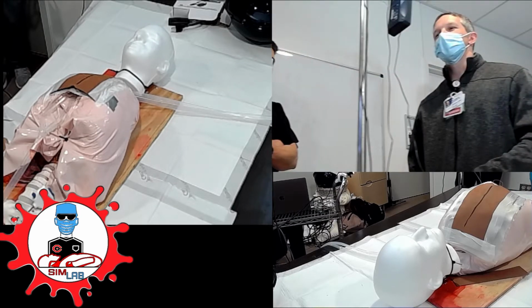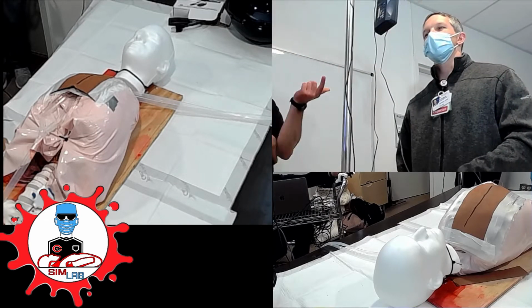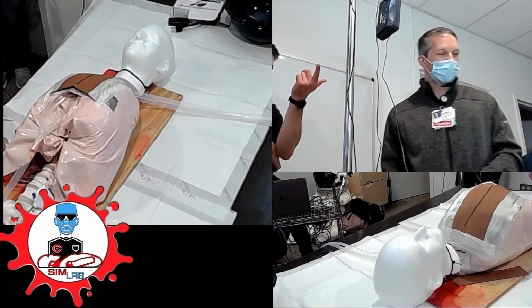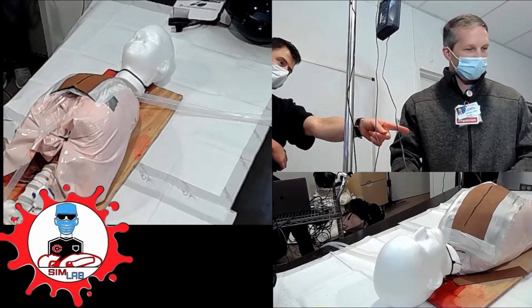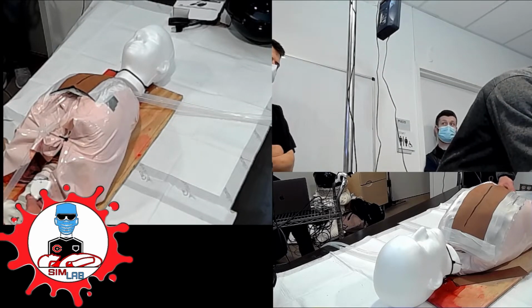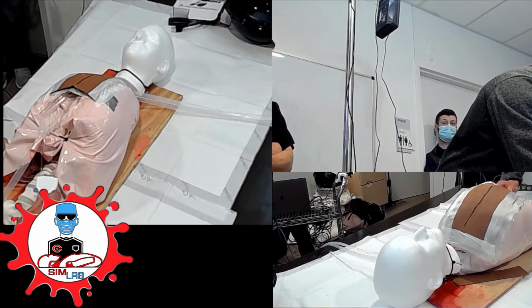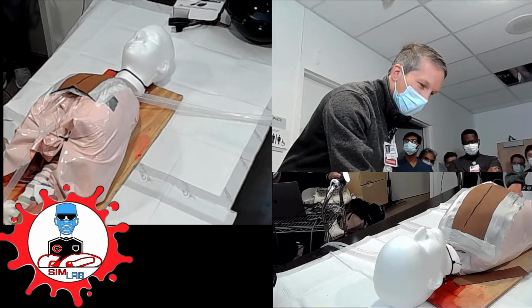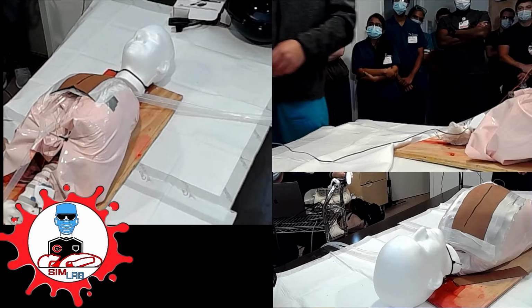So simple things first, right? You're going to check that it's connected. Okay, so it didn't get disconnected. Make sure that the V wires are actually going to the V, right? They're connected at their points there. Okay. Happy with that? Yeah. All right. Pacer is on? Yeah. Okay.